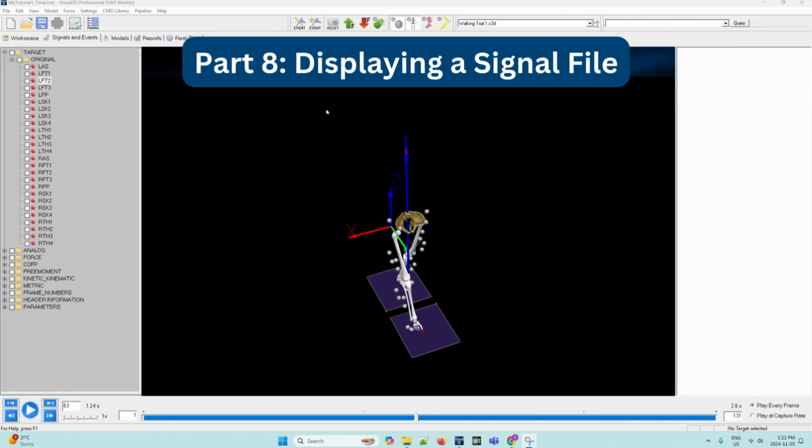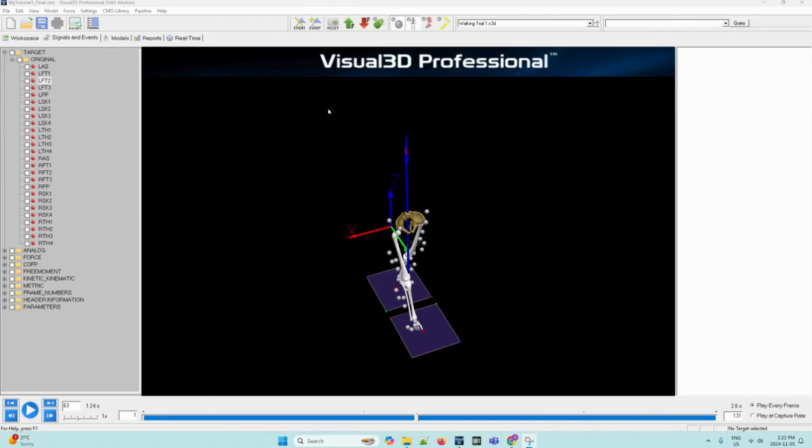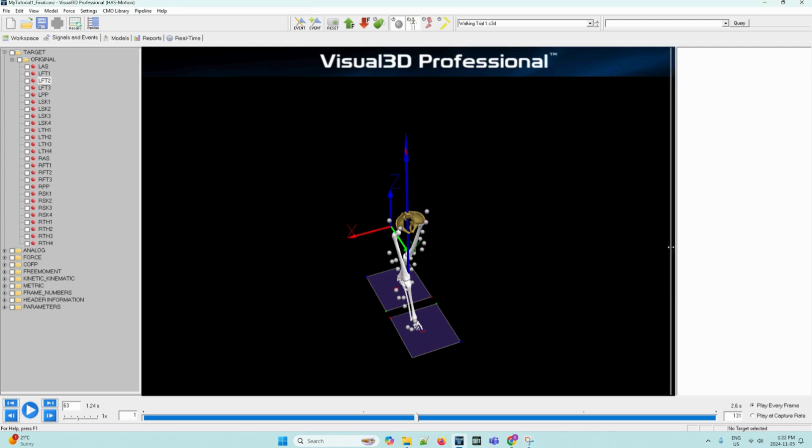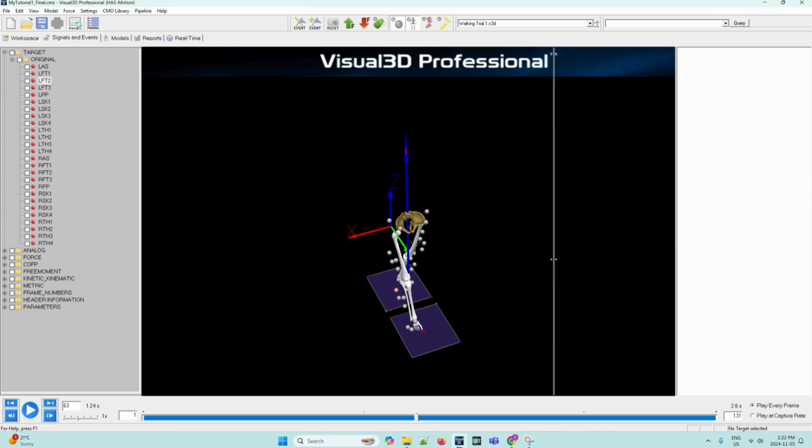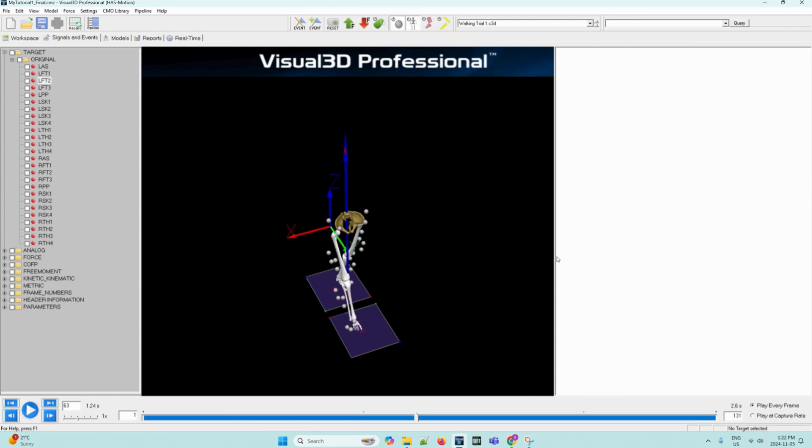There is another way to view signal graphs other than the signal data graphs in the data view window that we saw previously. These graphs that we will see are interactive and offer different viewing options of the data that we will explore later. When activated, signal graphs appear on the right side of the screen and can be used to visualize or add event labels. So we can move the viewing area of the model to the left by left clicking and dragging to make some room for the graphs that will be placed here.